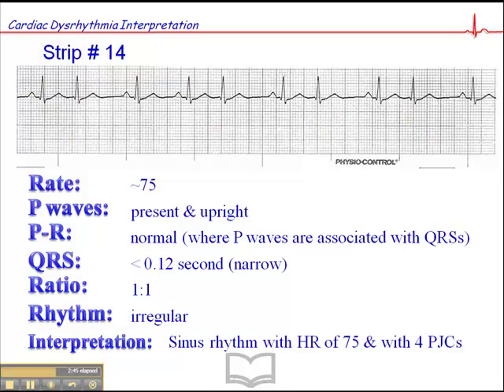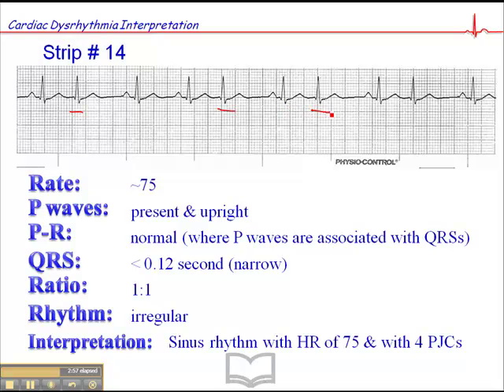The interpretation is sinus rhythm, heart rate of 75, with four PJCs. The PJCs are: normal, normal, PJC, normal, PJC, normal, PJC, and normal. So the final interpretation is sinus rhythm, heart rate of 75, with four PJCs.